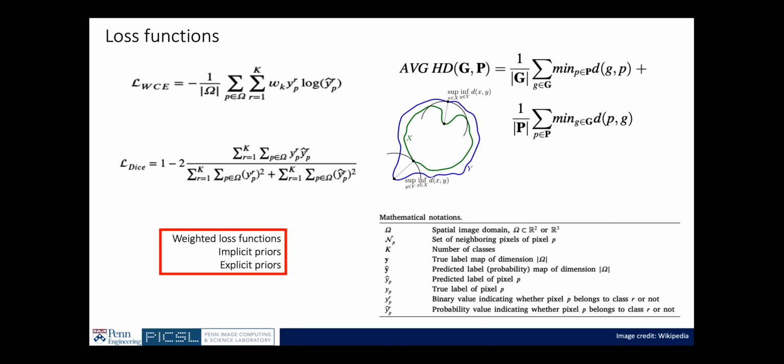What you can do is weight the different regions or the different predictions by the inverse of the volume. So you can give more weighting to a structure which you know will be missegmented in your output, and less weighting to a structure which you know is easy to segment. So you can always weight your outputs in your loss functions.